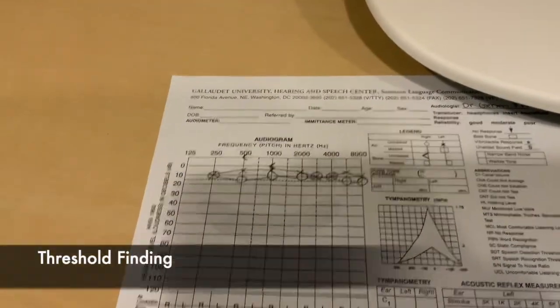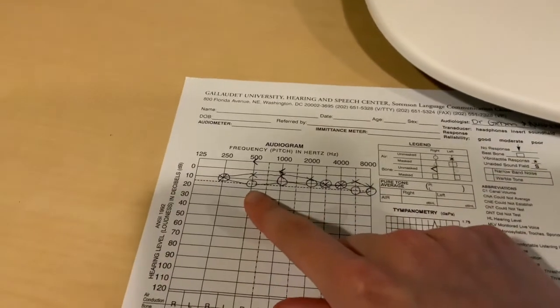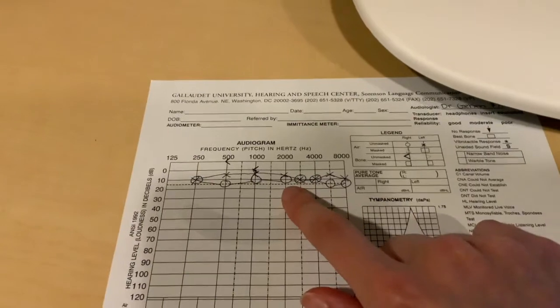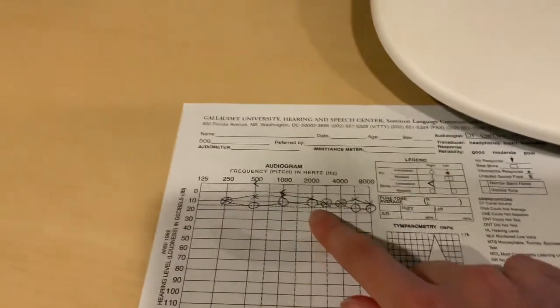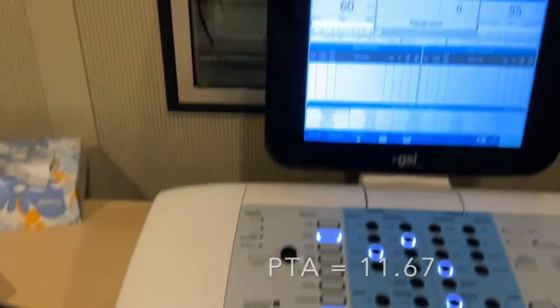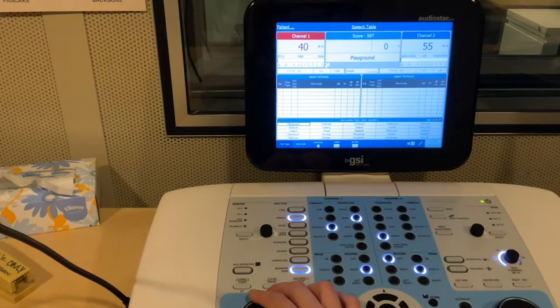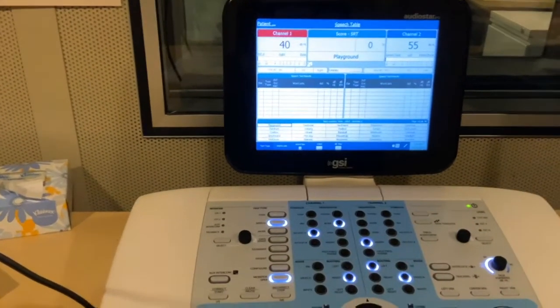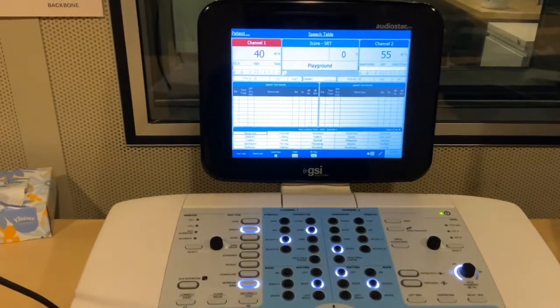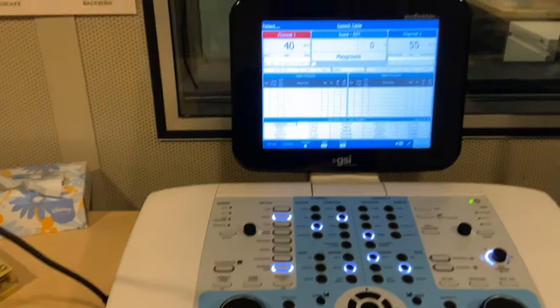So when we're looking at the audiogram that was collected, we can see in the right ear, which is the one that we're going to start with, we have thresholds of 15, 10, and 10, where our pure tone average is. So this is roughly 10 dB for our pure tone average. So we are going to start presenting at 40 because it is 30 dB SL above the pure tone average, which is our estimated SRT. When we present, we're going to want to familiarize six words, so we can hit interrupt.